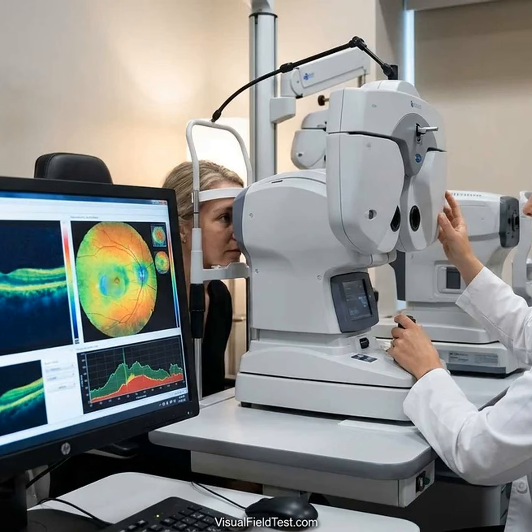Every eye is different. Is this normal for me? If the report highlights thinning for your age or race group, ask how significant it is. A finding slightly below average might be okay if all other tests, field exam, are normal.